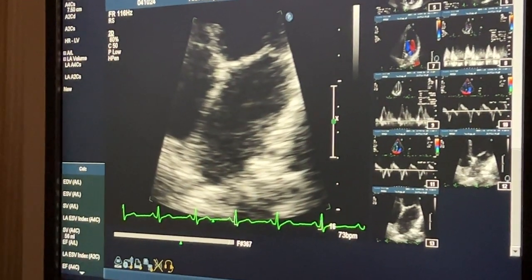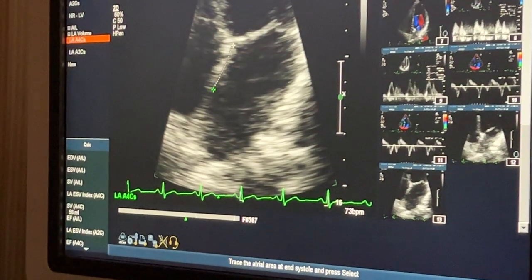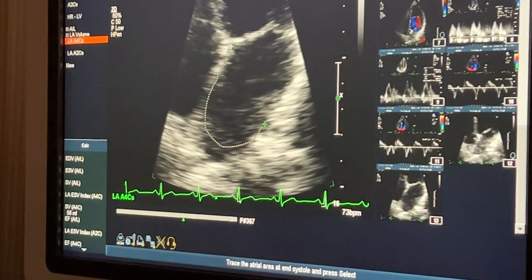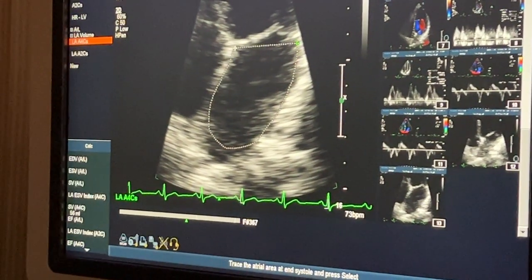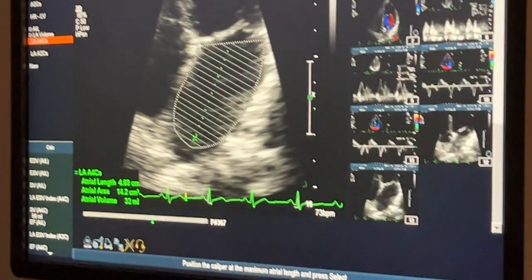Okay, well, I lied to you guys about the print button because that one didn't work. It's probably because I didn't click. I normally don't click, but that measurement needs you to click it on this machine, so my bad. Okay, I'll click it. And then, oh, that's why. It's because the measurement's not finished, because I get a left atrial length. I was going to tell you guys this.